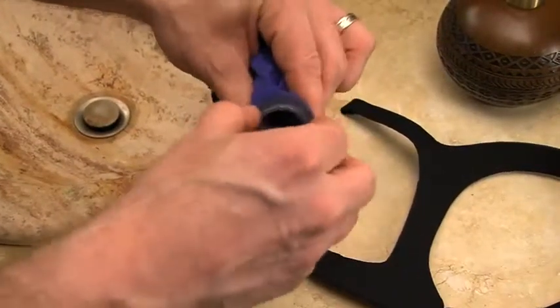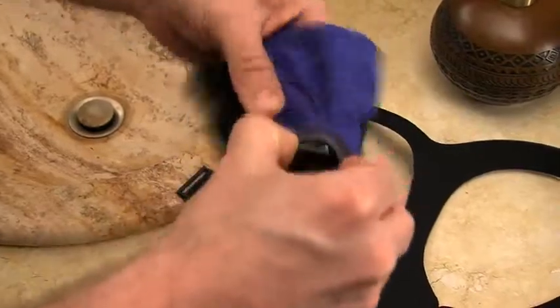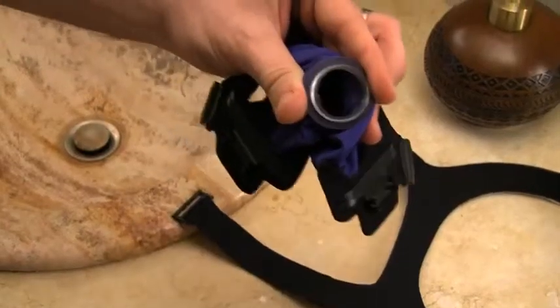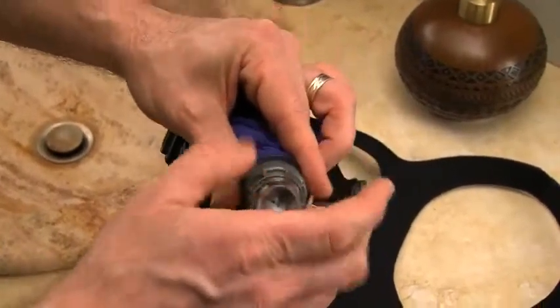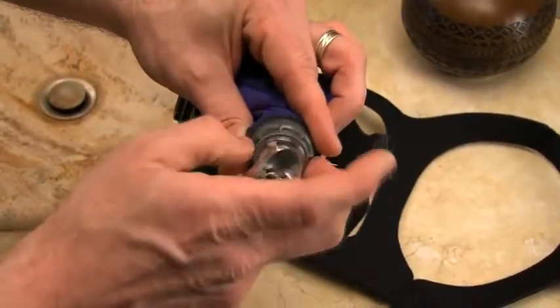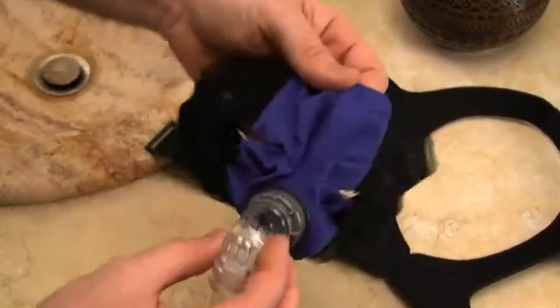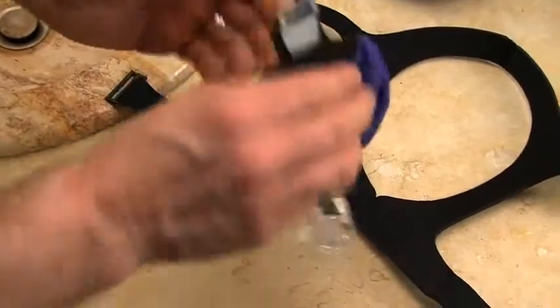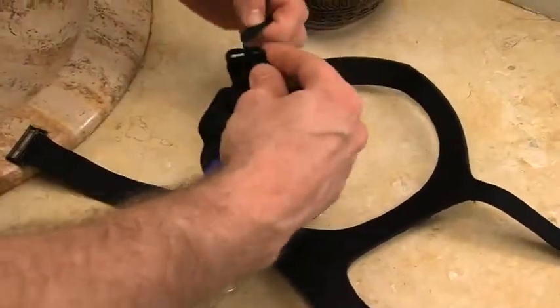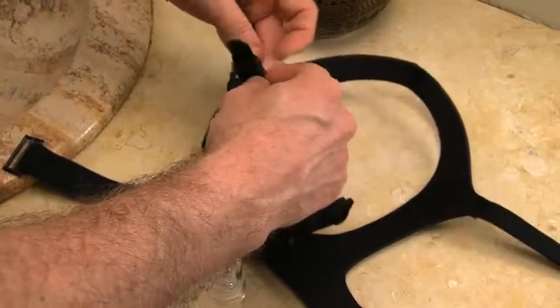Third, screw the nut onto the threaded piece to secure the swivel. To attach the headgear to the mask, lay your headgear flat with the product label facing down. Lay your mask bottom down and attach the top hook tabs through the top slots of the mask.